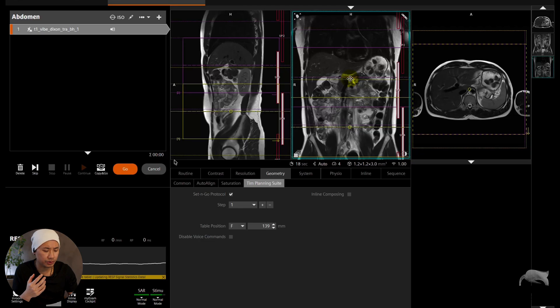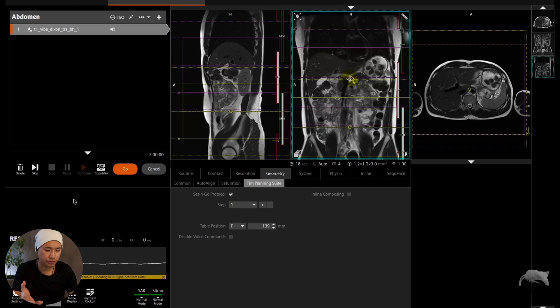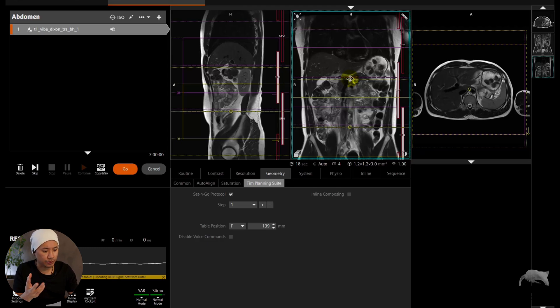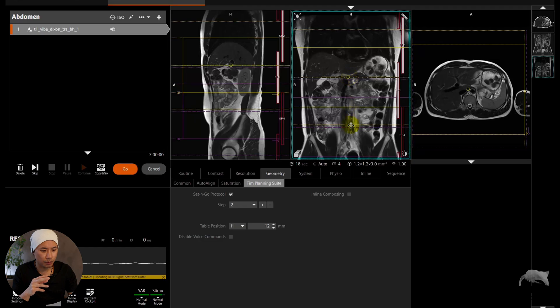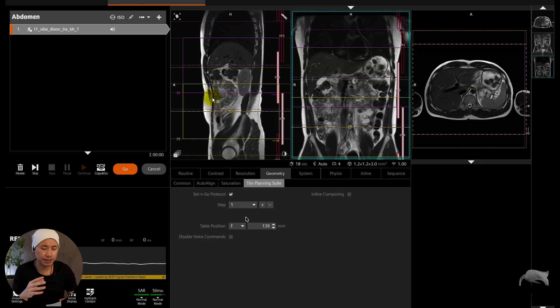You can see the overlap is somewhere in between here. You can see this is the first box, the second box is there. It just says number one, number two here because I just made it fast. Of course you want number one in the top and number two in the bottom. This is just an illustration how you can do this and how you can cover a large area of two boxes in this case. And if you needed a third one, you just add one plus there, you get the third one, but we only need two in this case.